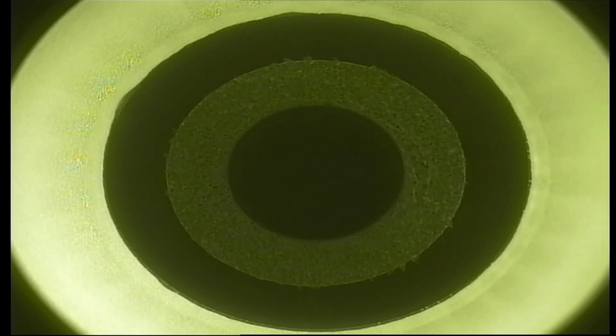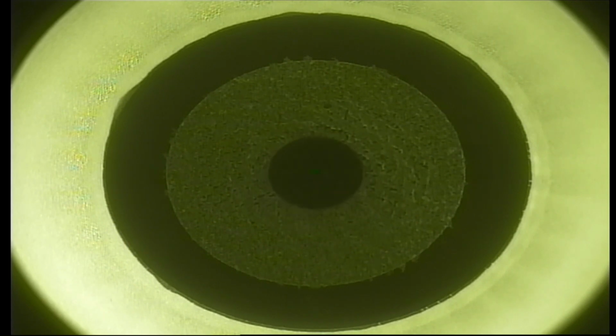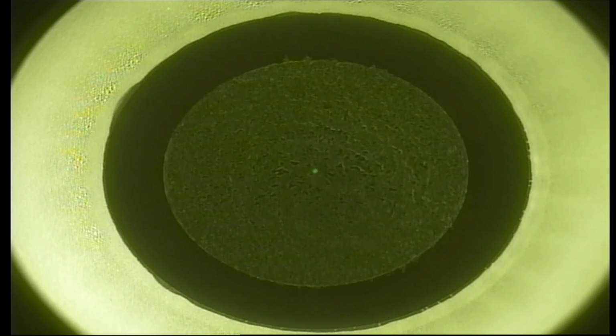Just touching the cornea. Don't move now. Suction on. There is a very small thread. It's not going to come in the way. Ready? Now the laser is firing. Don't move. 22 seconds. So the laser is firing. You can see the green light is about to disappear now. 15 seconds more. This is the side cut that has happened after the top cut.